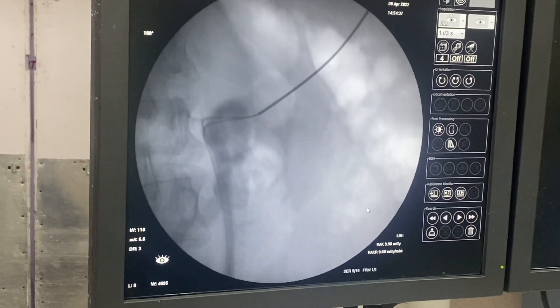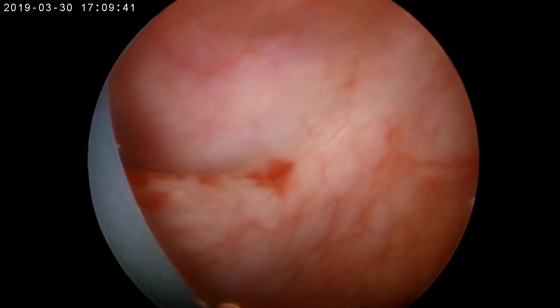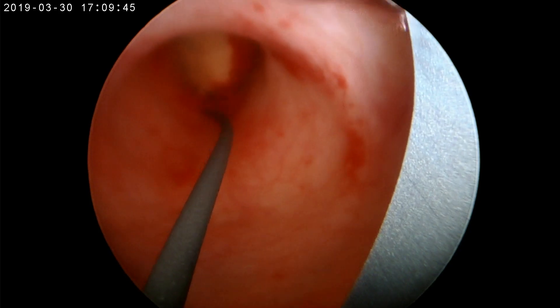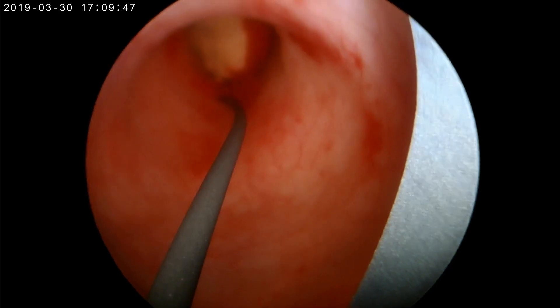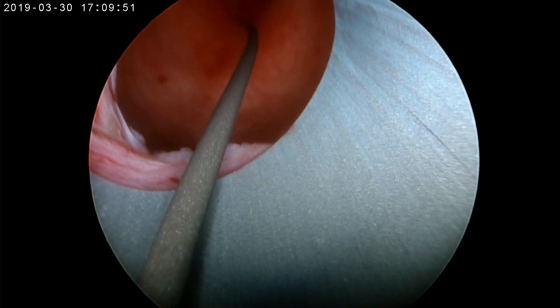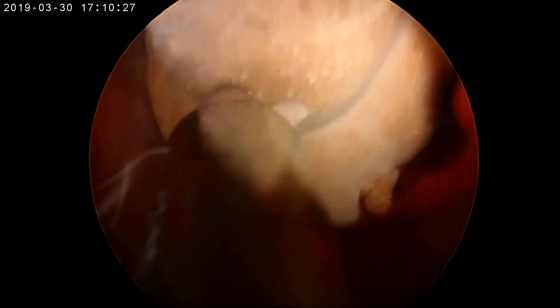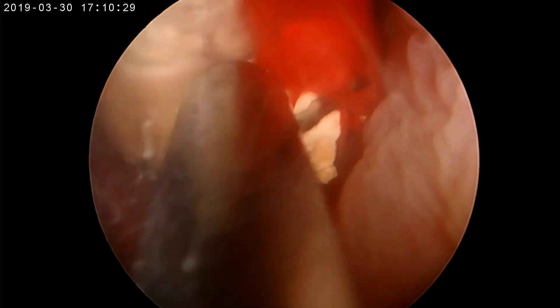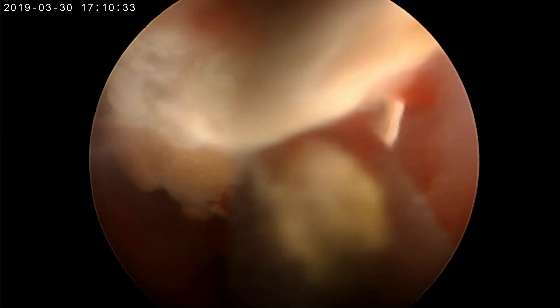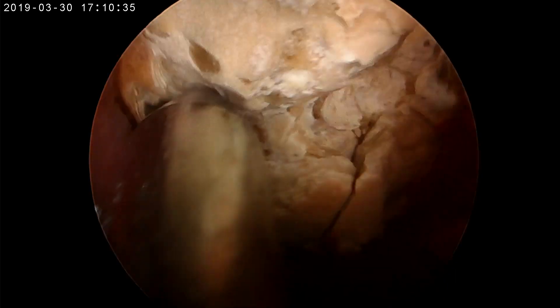Now a Terumo guide wire is passed and you can clearly see the guide wire going into the ureter. After the track was dilated, the puncture position should be verified. Checking the position of the calyx puncture: if you can see the infundibulum in front of you, that suggests you have done a correct puncture and gone through the papilla — that is why you are seeing the infundibulum in front of you.